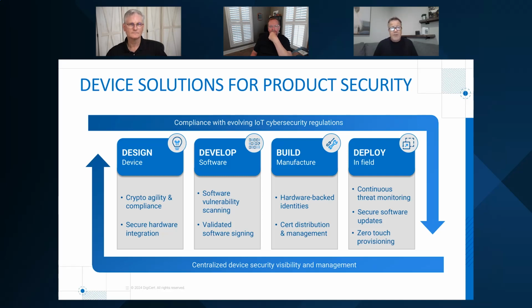And then are we monitoring those devices over the lifespan of the device? Are we monitoring the SBOMs and notifying our customers that, hey, there's an exploit now for a library we used and we have to patch it, and then securely patching the device over and over again for 5, 10 years, whatever that lifespan of the device is.